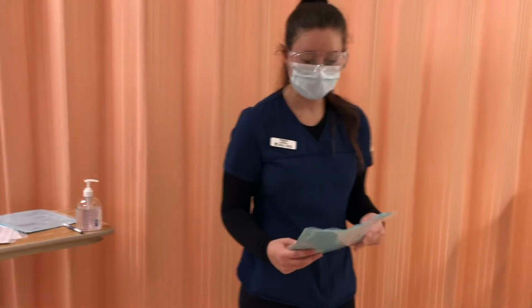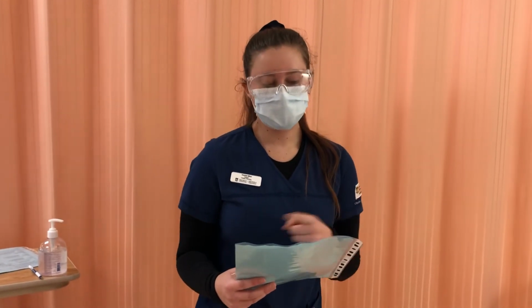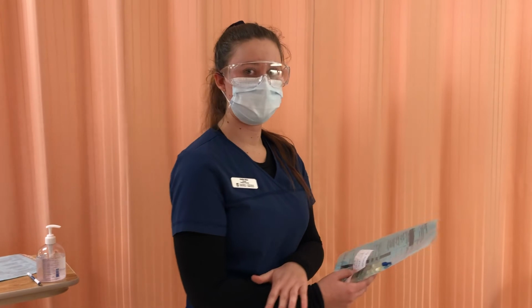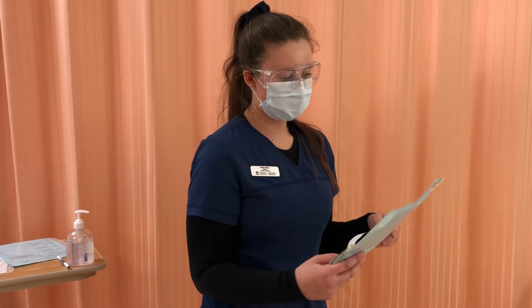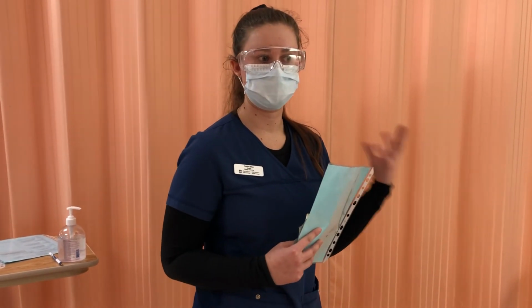What I'm documenting is the time I changed the bag, the second nurse signature, what the PCA dose was, what the lockout interval was, that it's infusing into the peripheral IV, that there's a TKVO infusion running as well, and that there's no redness, irritation, or swelling at the insertion site. My plan is to come back to frequently assess their vital signs, respiratory, and mental status while they are on the infusion to make sure they don't have any negative reactions to the medication. So I'll be documenting all of that now as I leave the room.